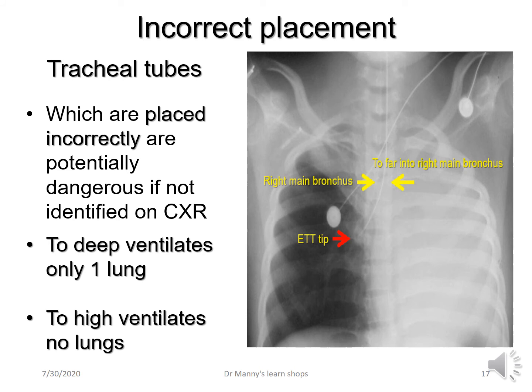Look at this chest X-ray. This is typically what would happen because of the location of the right main bronchus in relation to the trachea. It's a more direct route, so typically if the tube is in too far, it will go into the right main bronchus. This one is. It's going into the right main bronchus, and as a consequence of that, have a look.